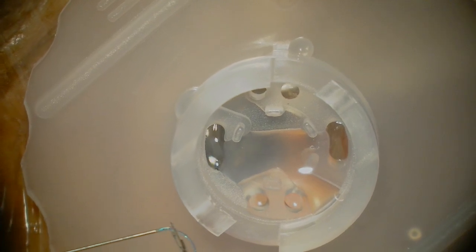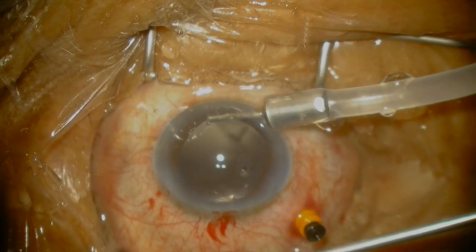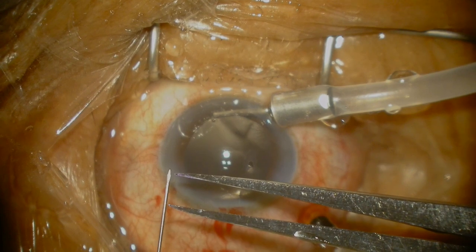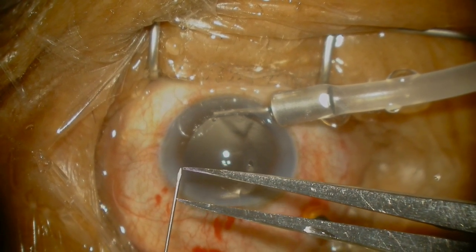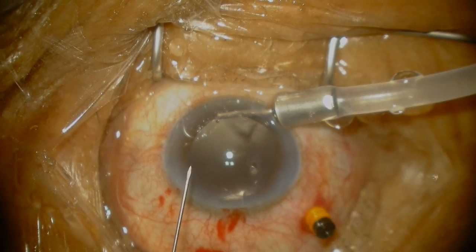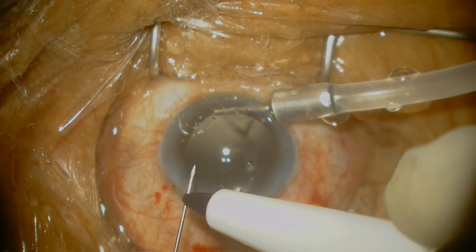The first thing is to check if your haptics fit. With thin-wall 30 gauge needles, what you want to do is take the intraocular lens — in this case an Alcon ME60 AC with PMMA haptics — and make sure they fit into the needle before you start. I prefer to mark the needle. You can use 2 to 3mm to determine the length of your intrascleral tunnel, and I prefer to mark the needle so that I don't have to use too many markings on the conjunctiva to guide my needle positioning.